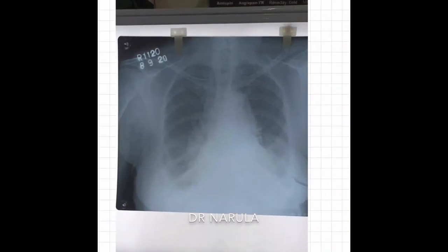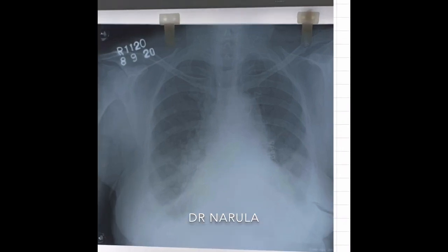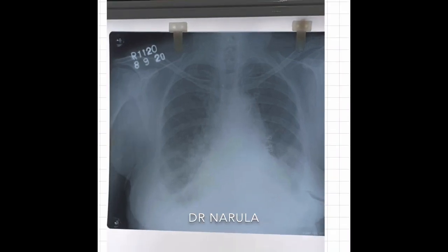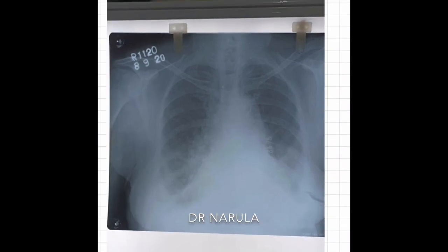I want you to see this X-ray and try to guess what is the pathology — what is the disease. You can pause the video if you want. Now I will explain, and we will do this systematically.